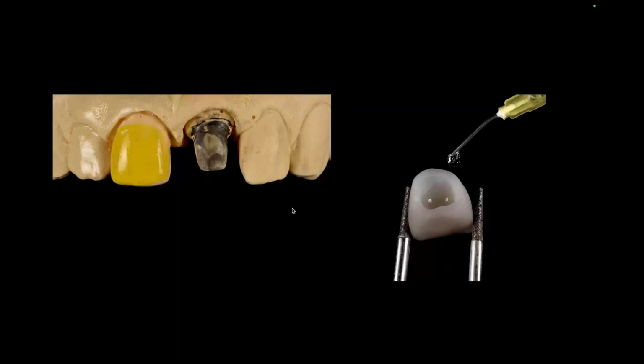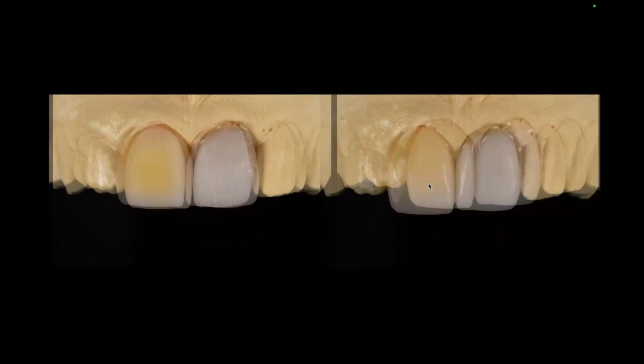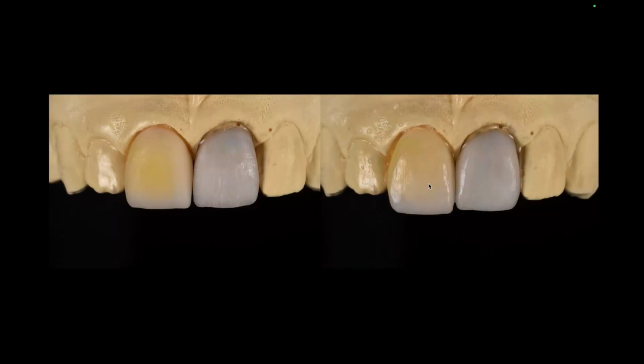Because again, you need a medium to grab onto the tooth. You're going to get coloration from the tooth behind it. So now look what happens when I put the glazing medium in. Same two restorations. You can see how much more light is passing through this one because it's adhering to the tooth. And now you can almost start to see that this looks okay, but the value is going to be different. And even in the brighter materials, value is going to be different. Watch what happens when I put the black die behind it. Now you see how my value completely drops.